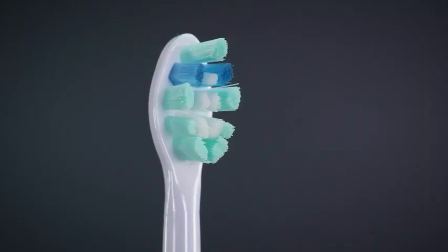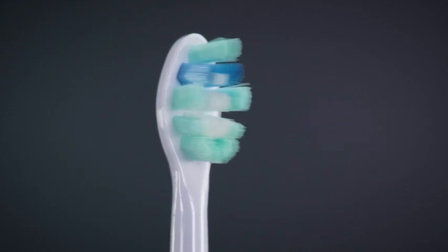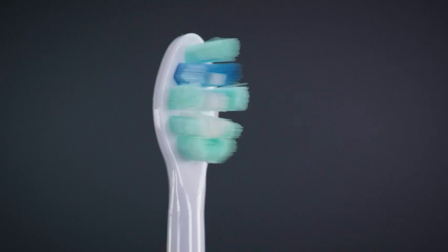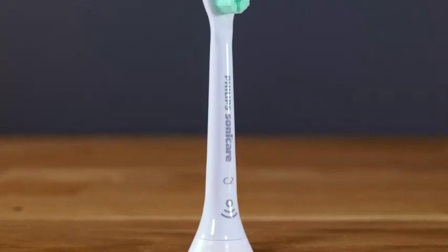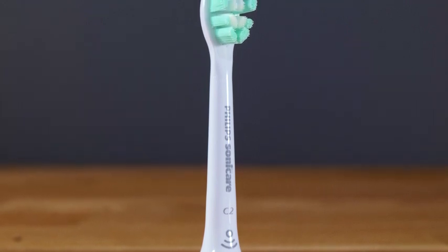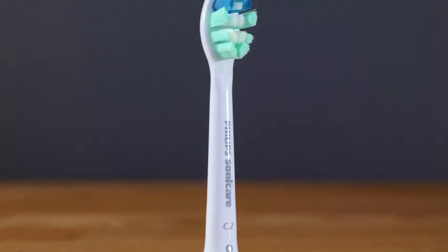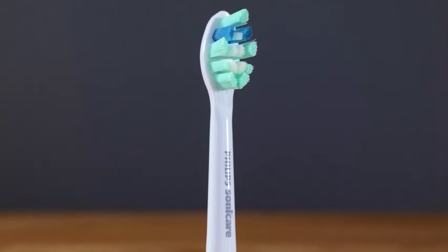The blue coloured bristles will actually fade over the weeks and months of use to a pale blue or translucent colour. This is intentional and is a visual reminder to replace the head. The body of the brush head is made from a smooth to the touch plastic. It isn't harsh on the soft gum and cheek tissues of the mouth, but it does not have the rubber coating to the back of the brush head like some other premium Sonicare brush heads.